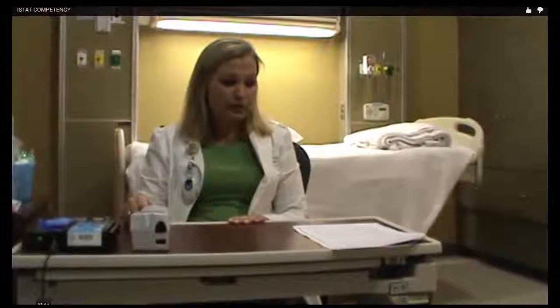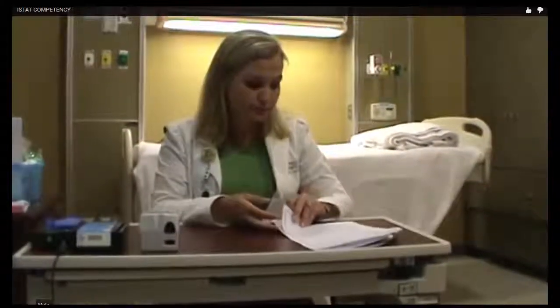The most important thing with the iStat is to have everything prepared and laid out and ready before you draw your specimen. You can draw one of two ways. You can either draw in a heparinized syringe, that'll give you a little bit more time, or you can draw in a plain syringe. We'll draw in a plain syringe for the demonstration, and we're going to use a Chem 8 cartridge. You want a venous stick. You want to observe all standard precautions.